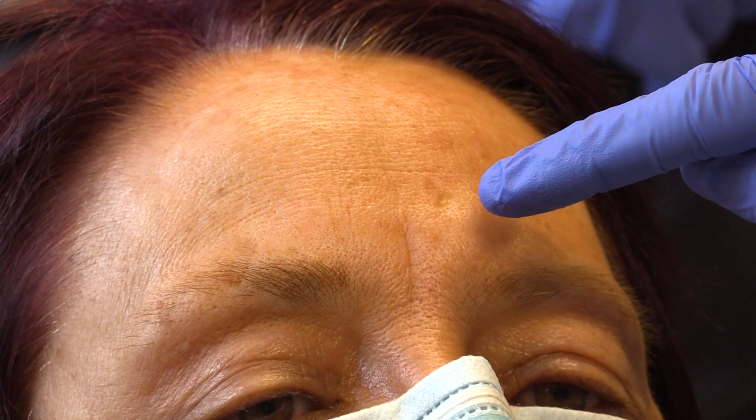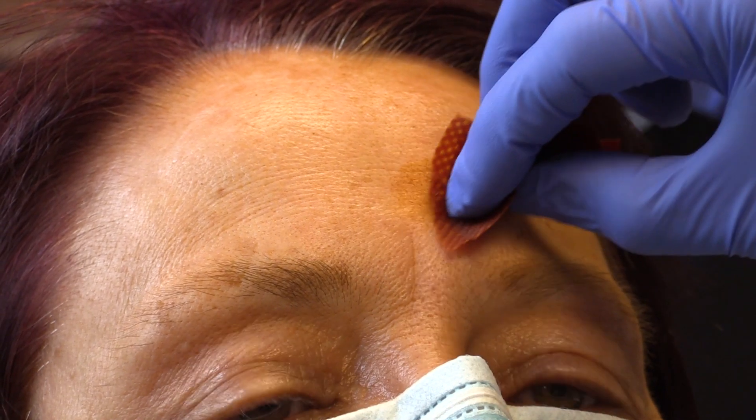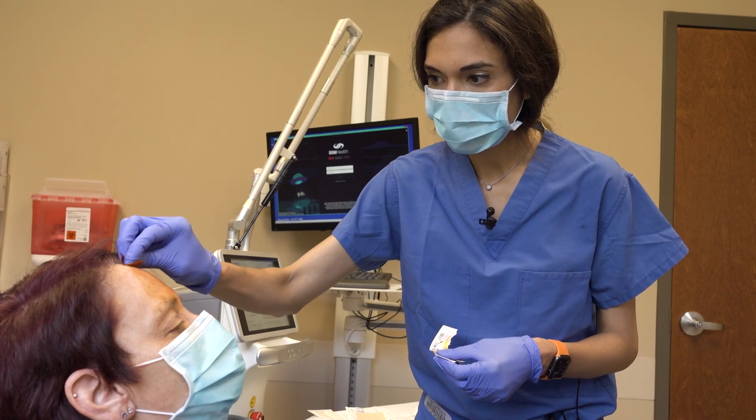The first step in the procedure is to identify the scar, which in this case we have right here on the forehead. So we clean the skin. This is not considered sterile, but it is considered clean.